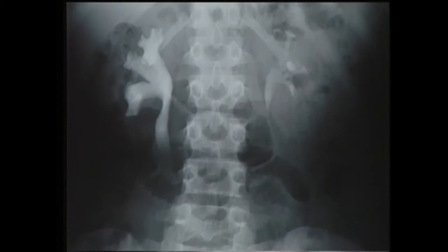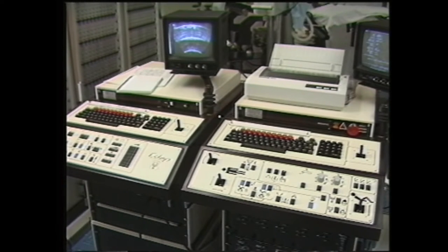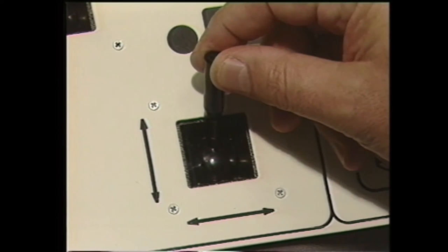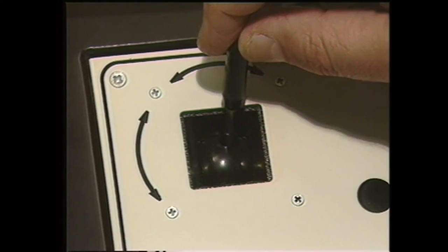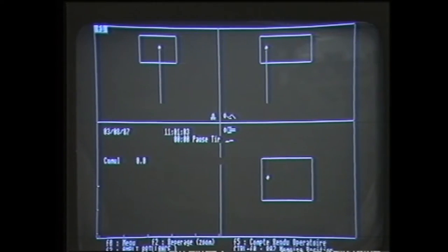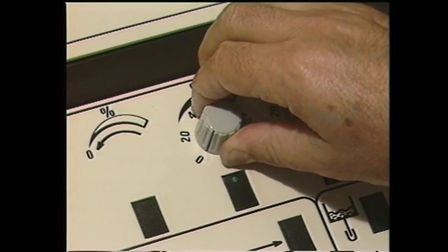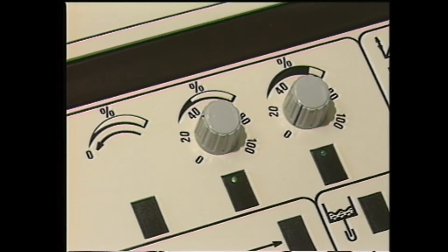Cette urographie faite chez une fillette de 10 ans montre une importante dilatation du système excréteur due à une pierre obstructive du bas uretère droit. Pour des raisons de repérage ultrasonographique, il est important que la vessie soit pleine pour pouvoir pratiquer le traitement. Après repérage et positionnement, souvent difficiles pour les calculs du bas uretère, nous commençons le traitement en augmentant progressivement l'intensité de l'énergie des ondes piézoélectriques.